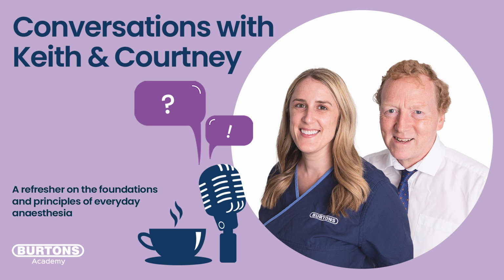So what we do with our circle system is it's a huge system, isn't it? You've got tubing, you've got the CO2 canister, you've got a reservoir bag as well, and that's all full of room air. If we think about numbers, we know that room air is about 21% oxygen, and then there's nitrogen in that room air, about 79%. We have to get that nitrogen out and fill up that whole system with 100% oxygen, or as close to as possible, for our patient's anesthesia. We do this every single time we use the circle system. I'm sure you just perhaps didn't know there was a term for it. We increase that fresh gas flow for the first 10 or 15 minutes.